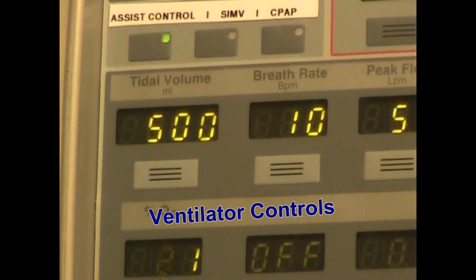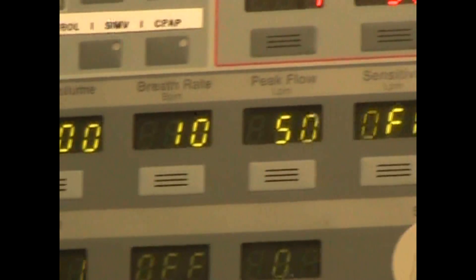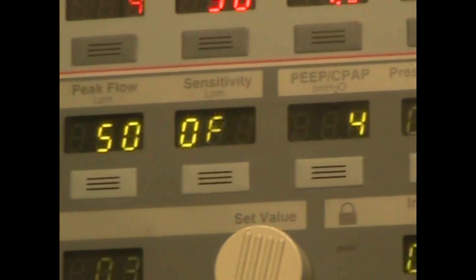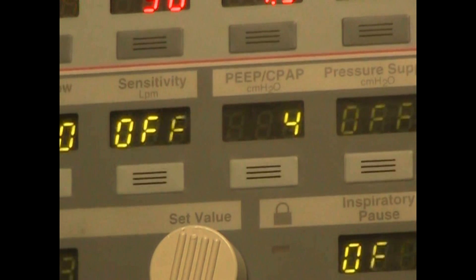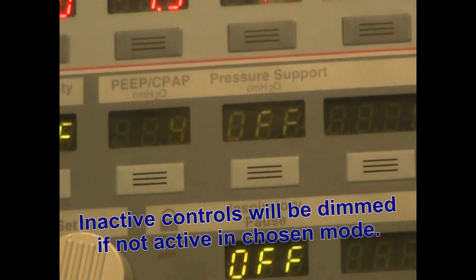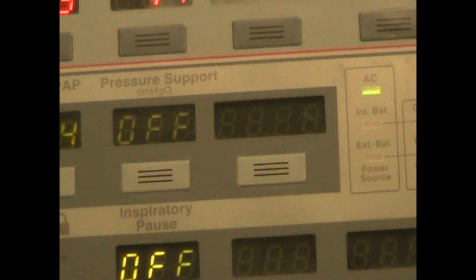In the control section we have tidal volume, breath rate, peak flow, and sensitivity, which right now is turned off. We also have PEEP/CPAP and pressure support, which is turned off. There is a last unlabeled control which is for additions in the event something else comes available.